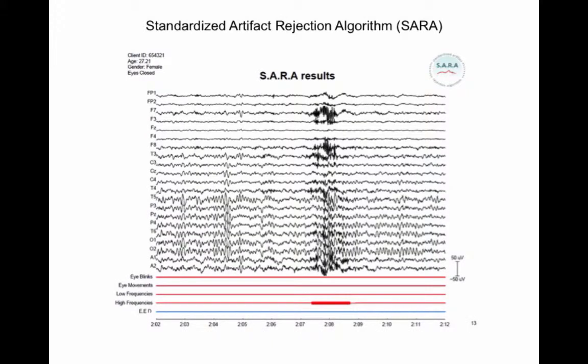In the next example, SARA has detected and rejected a high-frequency artifact, caused by muscle tension in this case.